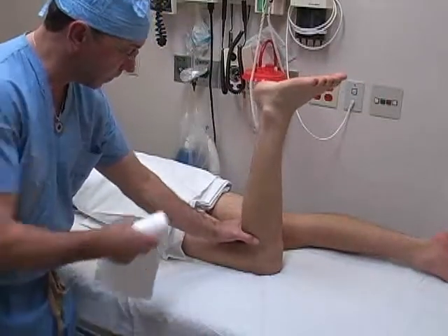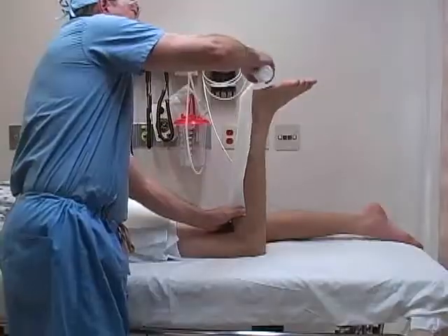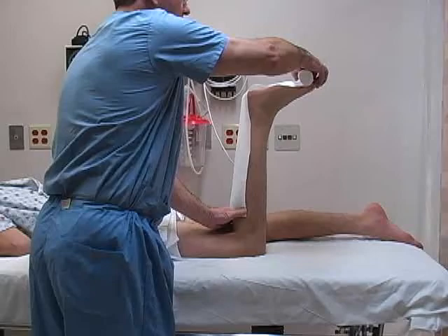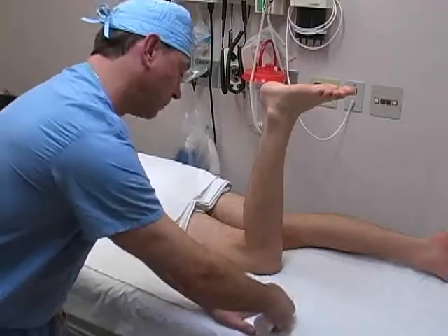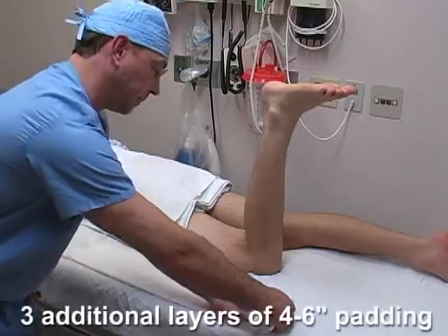Use a piece of 4- or 6-inch webrill to measure the required length of the splint. Measure from the proximal posterior leg down around the ankle and then to the level of the metatarsal heads. Lay this piece of webrill onto the bed and then roll out an additional three layers to form the cast padding.